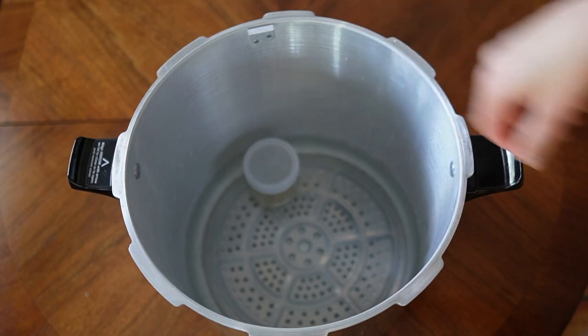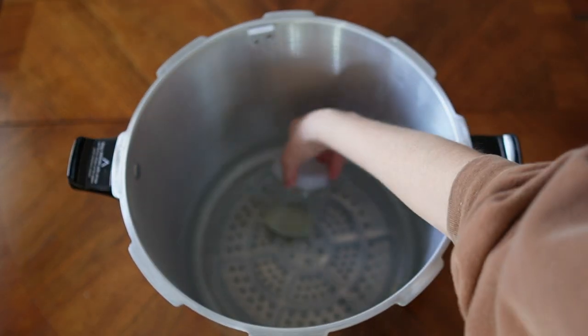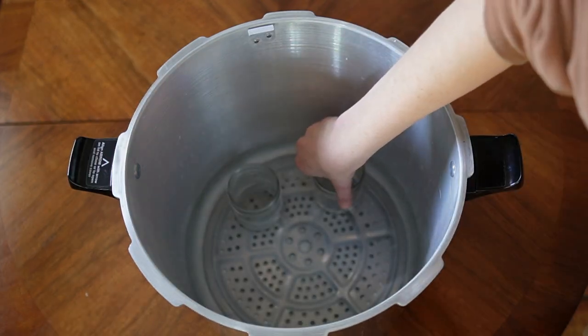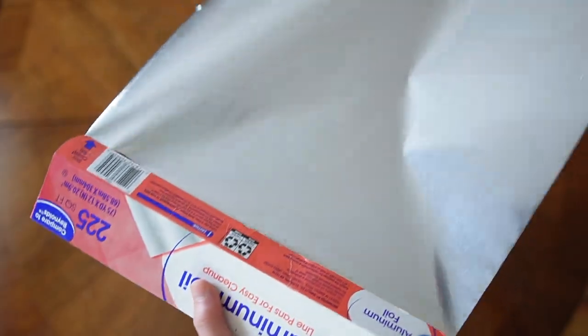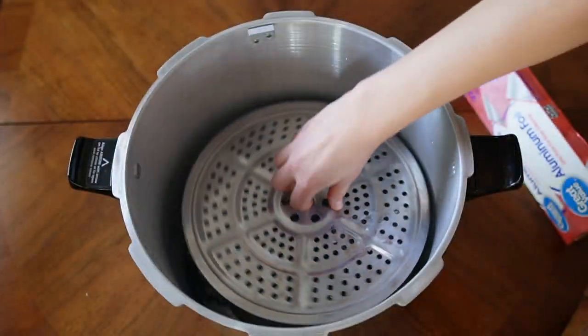If you put the jars of media directly in the pressure cooker now, they would be partially submerged in the water, which we do not want. You can buy spacers to keep your jars out of the water, but I just create a small platform using empty jars. Alternatively, you can create a platform by crumpling up some aluminum foil and placing it on the bottom cooking rack to create space so your jars aren't sitting in the water.